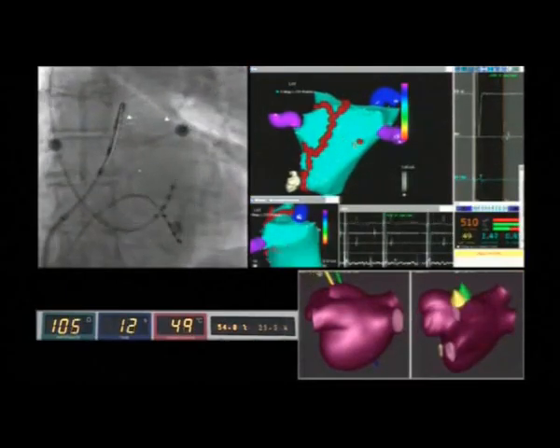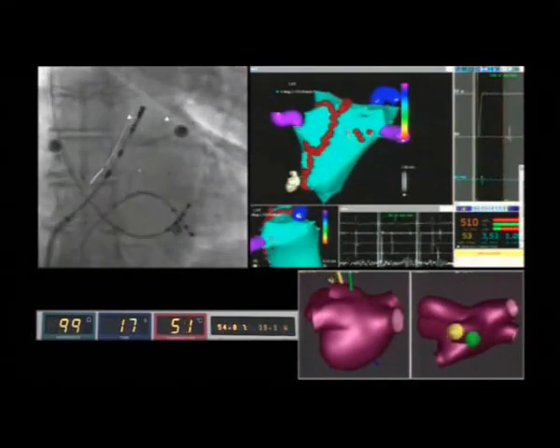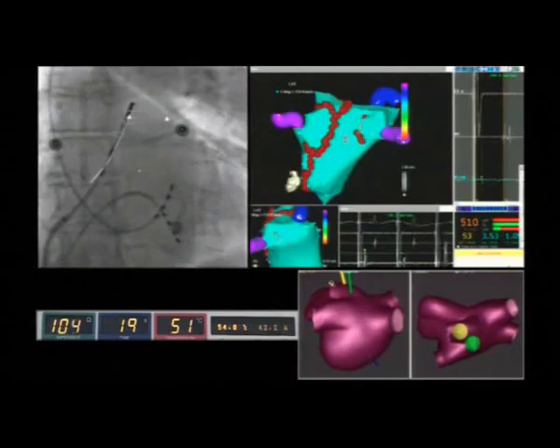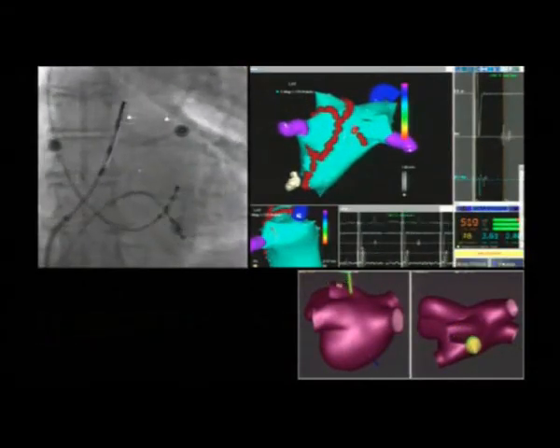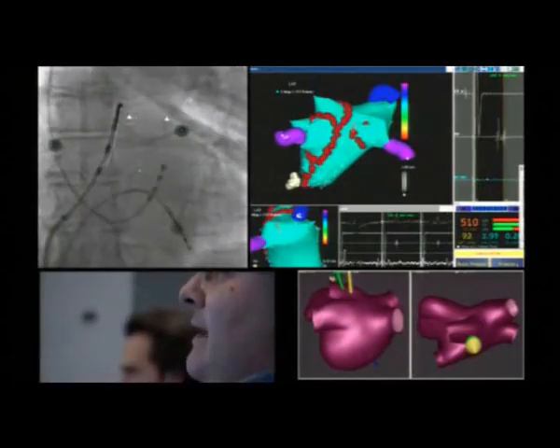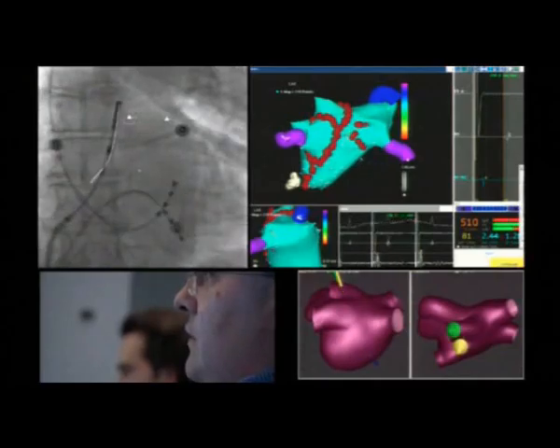With the stereotaxis remote system, even the septal region, considered to be challenging, the circumferential lesions can be easily and quickly performed, as you can see, thanks to the great stability and excellent adherence of the soft magnetic catheter to the atrial endocardium.